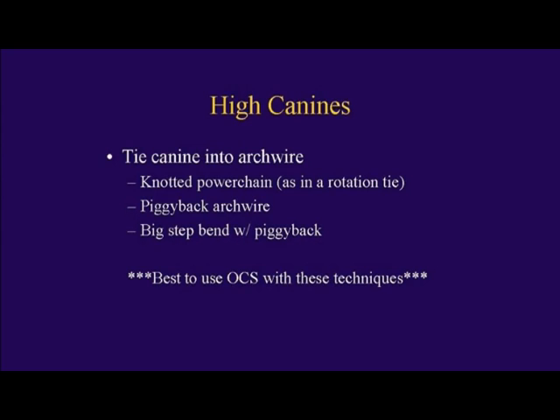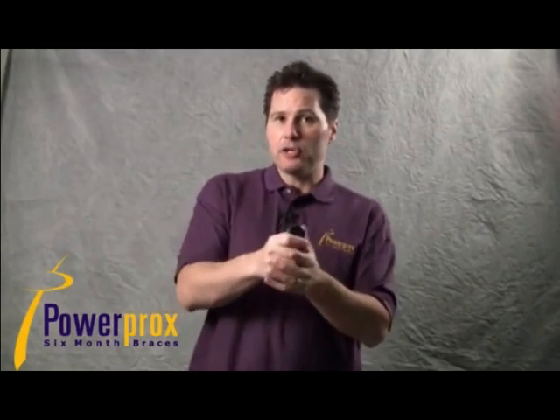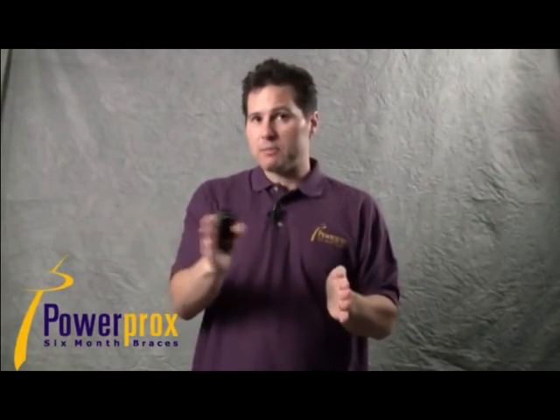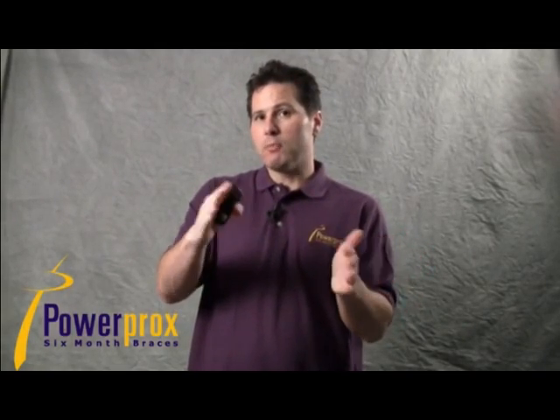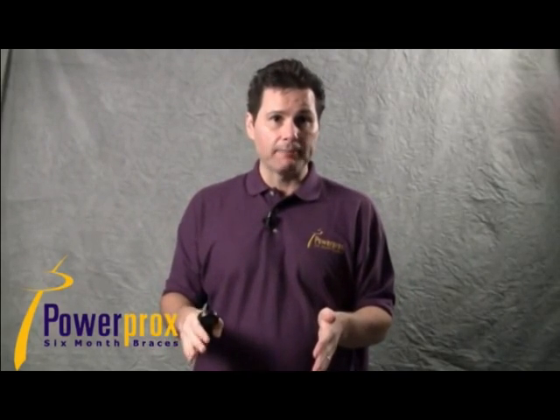Now it's best to use open coil spring with these techniques, open coil spring between the lateral and first premolar, so you can maintain space for the canine to come in, and if you're using a power chain, it allows you to keep that chain from sliding around on the arch wire, and also if you need to pull that tooth mesially or distally, you can change the direction that it's pulling.